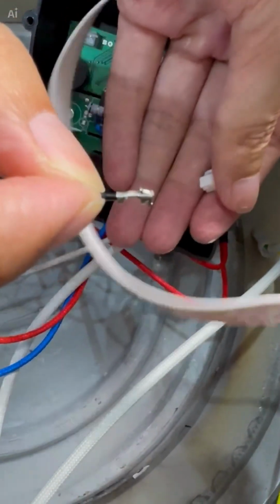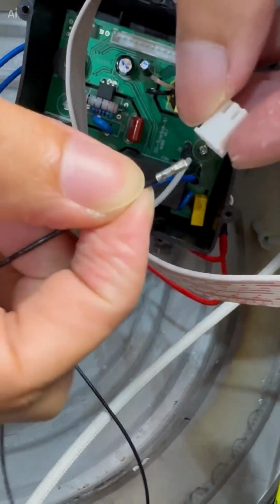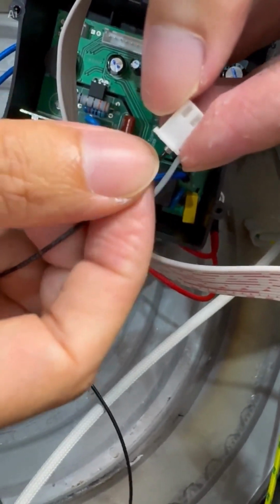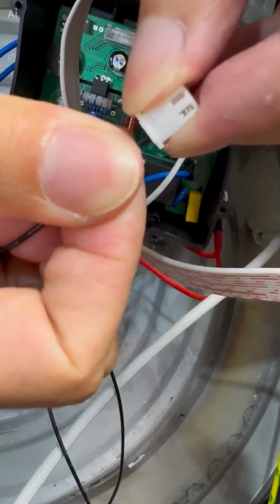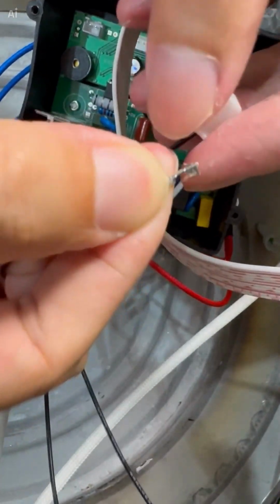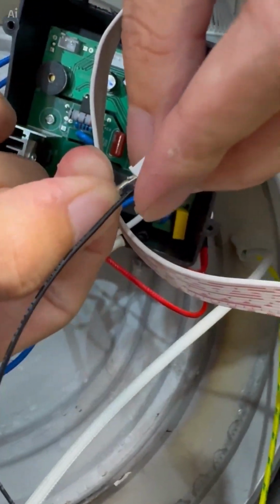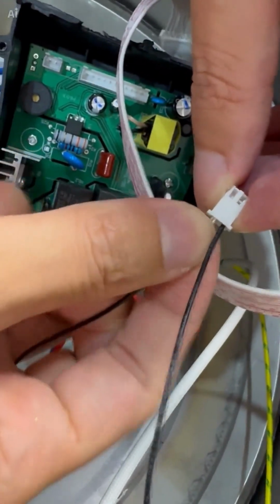Can you see this raised part? This raised part, then the notch and the raised part in the same direction, then insert it like this. Now look, this way it can be secured. Then the other one is the same. Here the raised part, the little piece that is lifted, aligns with the notch in the same direction. Like this, insert it like this.